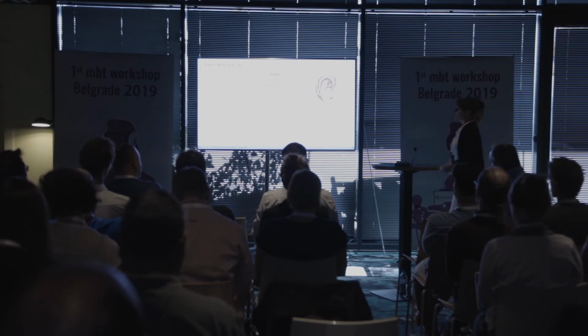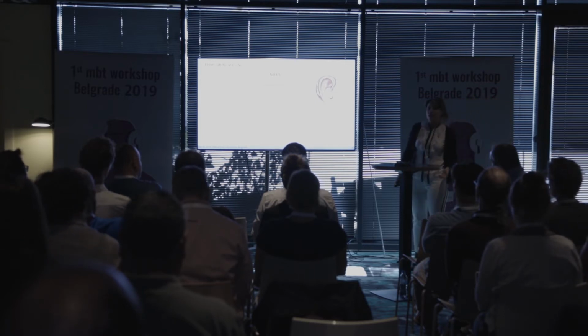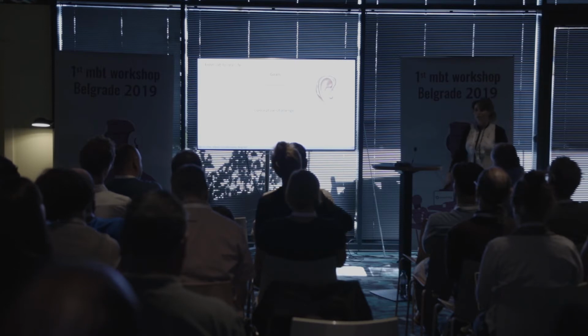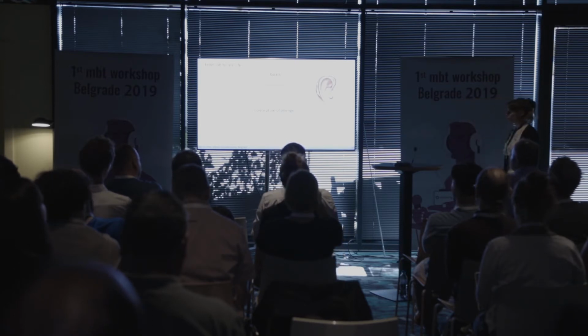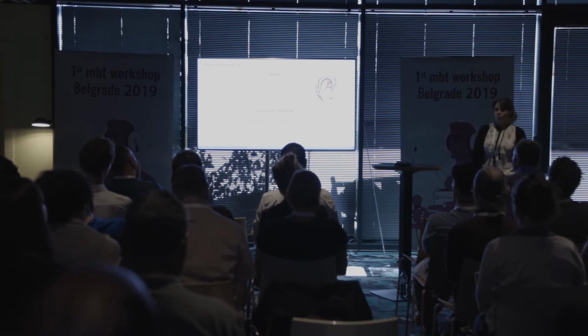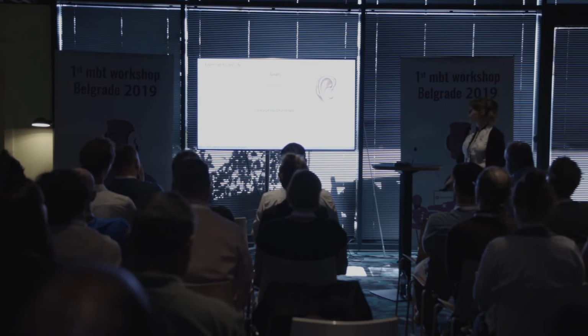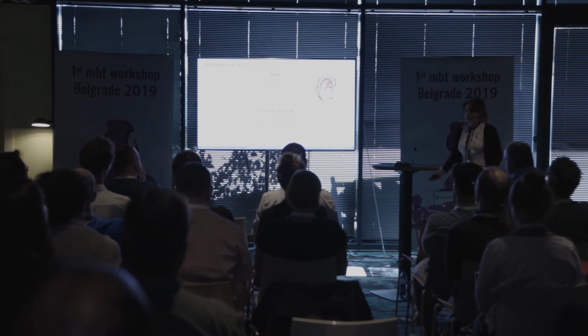And there are certain challenges that we have to overcome in order to do that. So you've heard a lot about challenges with mobile EEG, but I will just address two of them right now. One is there is a multitude of overlapping stimuli. So basically, we are bombarded every day, in every moment, with visual and auditory information. And there is no isolated stimuli like in a lab, basically.